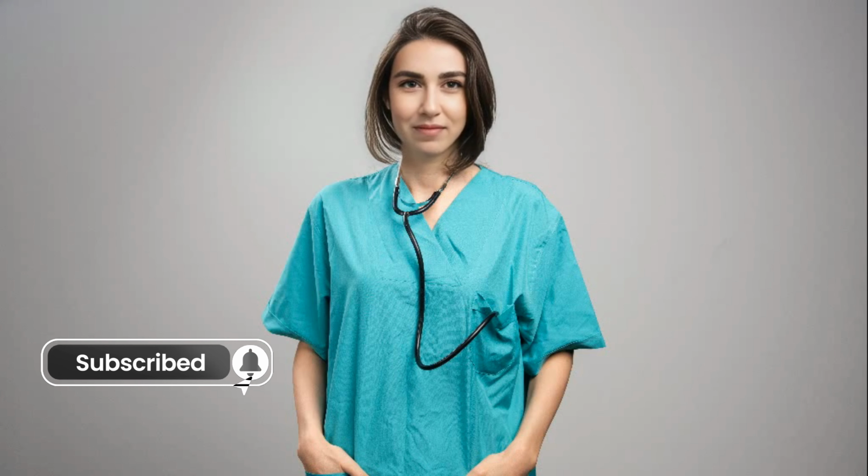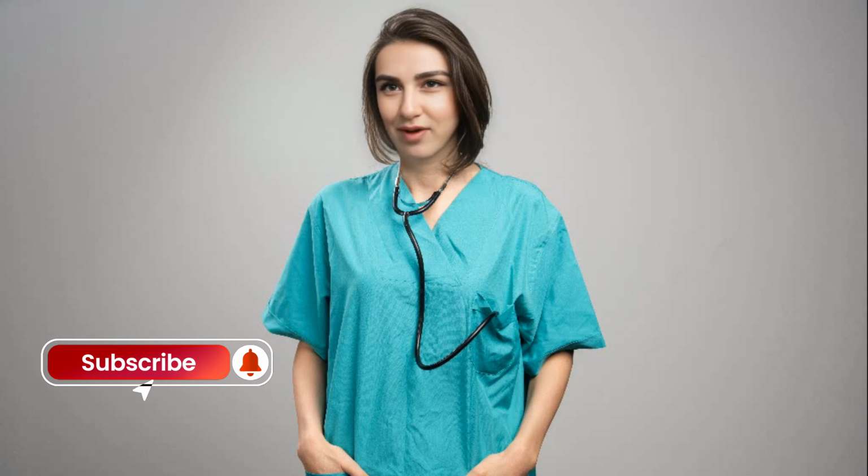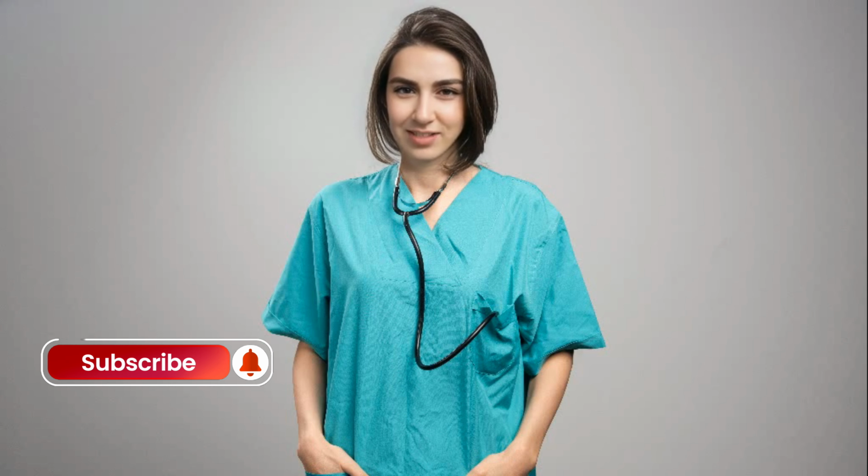It is one of the most frequently performed cardiac procedures worldwide and is used to relieve symptoms like chest pain, angina, and reduce the risk of heart attacks. Why is angioplasty commonly used for heart disease? 1. Minimally invasive. Unlike open heart surgery, angioplasty is a minimally invasive procedure that requires only a small incision, typically in the wrist or groin. This reduces recovery time, risk, and discomfort.